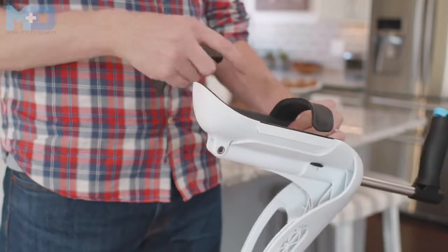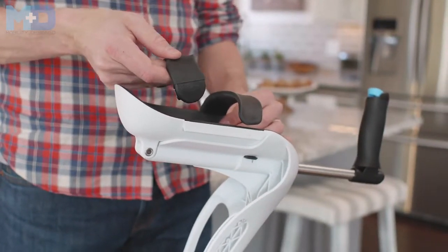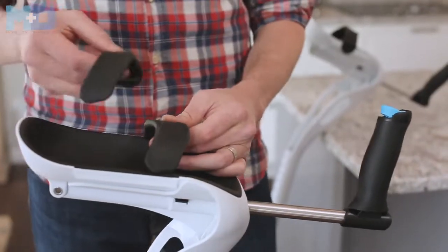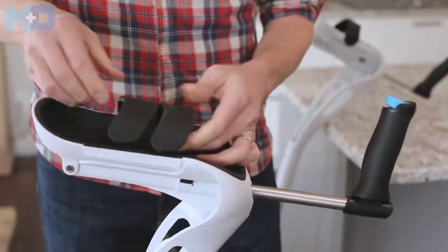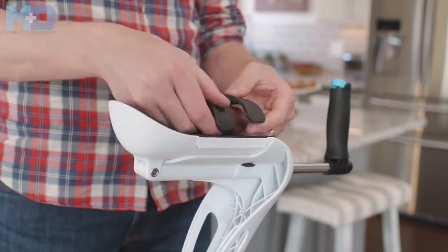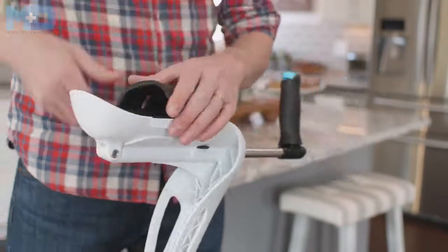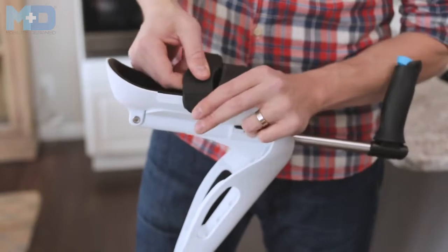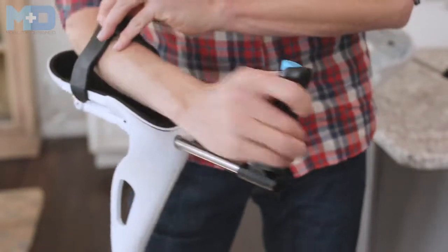Some users like to use a couple of lefts or a couple of rights, depending upon how they like their crutches set up. To use a couple of lefts, you would take one of the lefts from the other crutch and place it on the rail like so. You always want to make sure that that curve matches your arm. This allows you to easily get in from the side. Personally, what I like is where they're overlapped like this and allows you to easily flex and slide in.